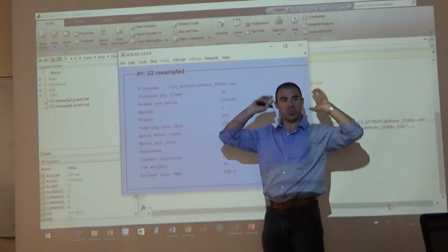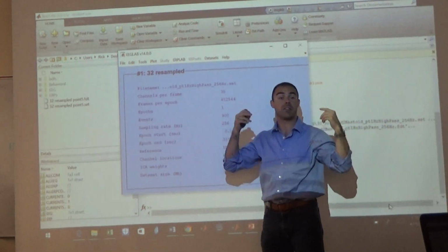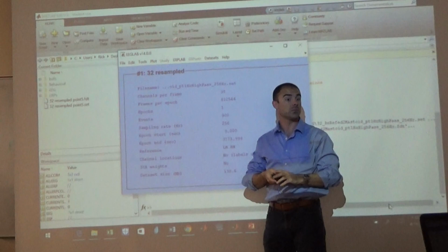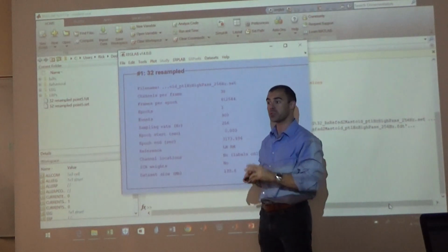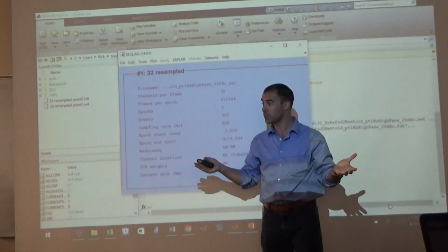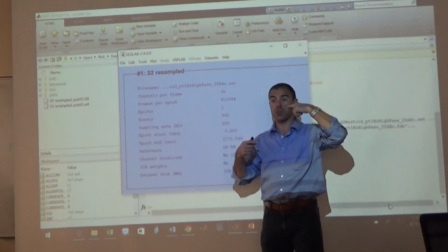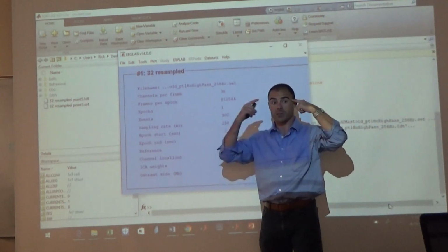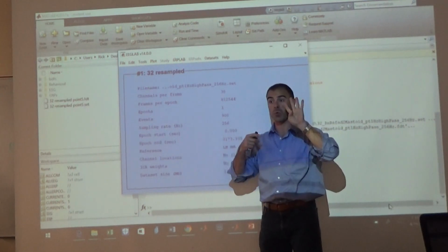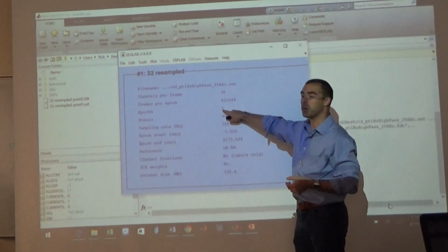And then you've got your two mastoids, and you've got a handful of your eye electrodes that add to create 38. Okay? So 2 mastoids plus 32 is 34, right? Then VEOG, VEOG, HEOG, and HEOG. It's 4 more, 38.